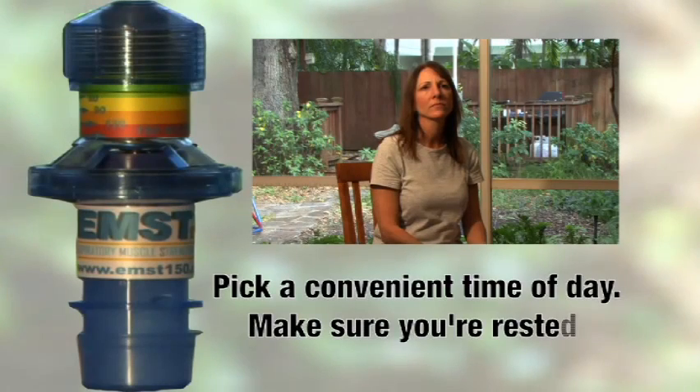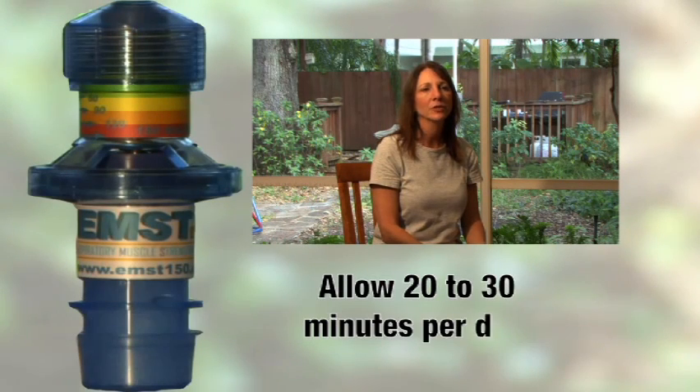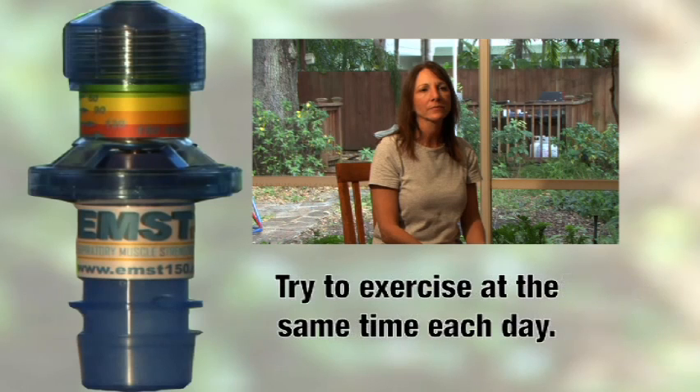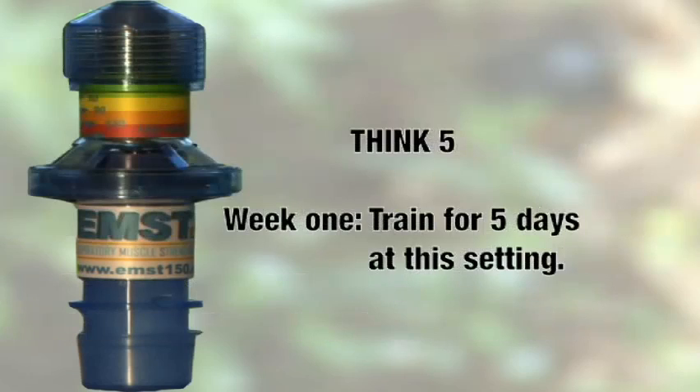Pick a time of day where you have time to train and are not tired. It will take you between 20 to 30 minutes per day. Picking the same time each day is also recommended. You can either sit or stand, although we recommend sitting down when you are doing the exercises. Remember, during week 1 you will train 5 days at this initial setting and then the levels will be adjusted.